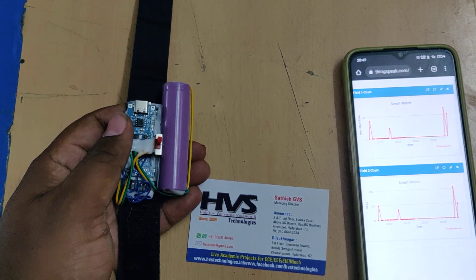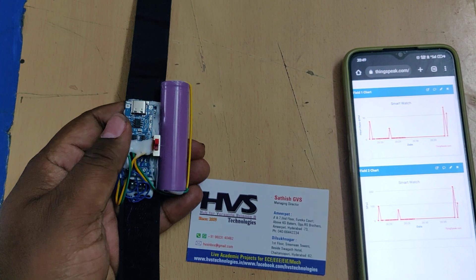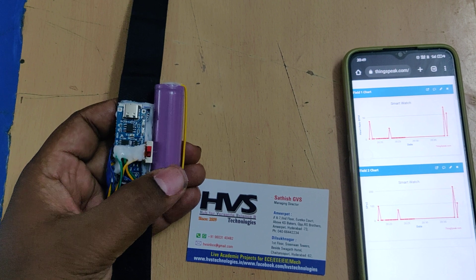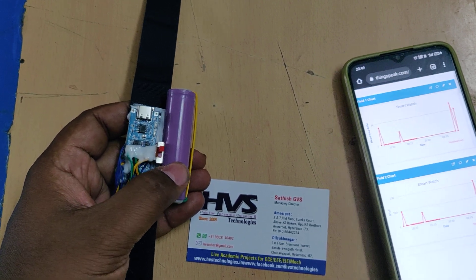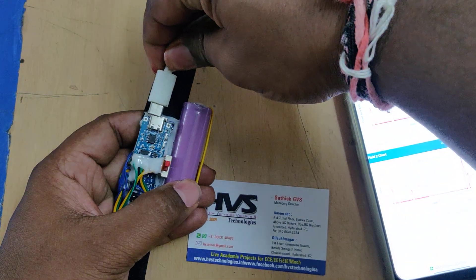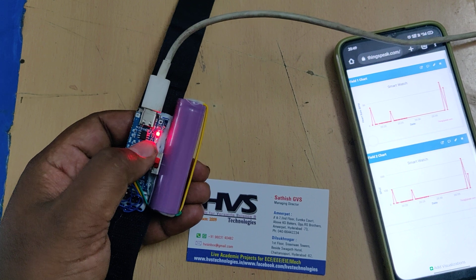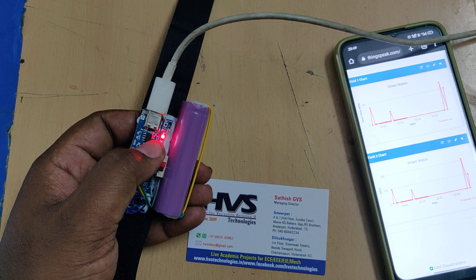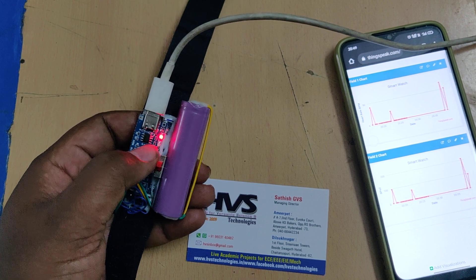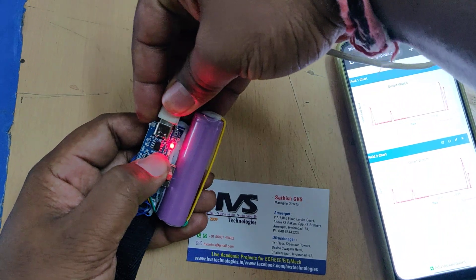The whole system gets power supply from a lithium-ion battery of 3.7 volts and 2600 milliampere-hour rating, which is rechargeable. To recharge the battery, just connect the C-type charger here and the red light will show the charging status. Once the battery is fully charged, the red light will switch off and the blue light will switch on, indicating the battery is fully charged.